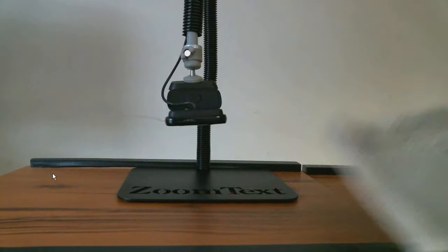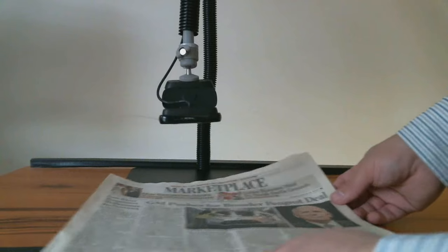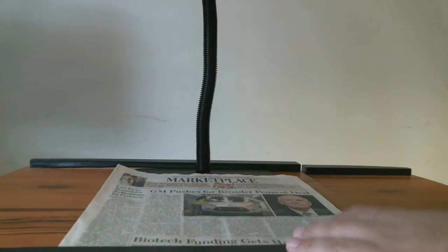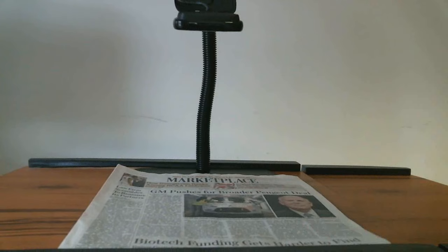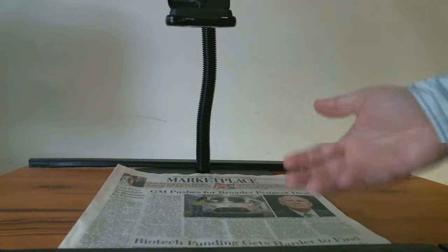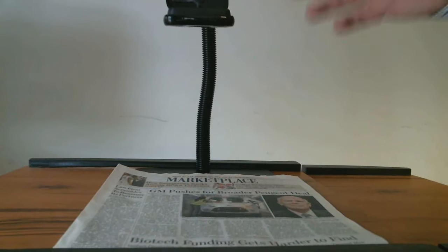So let's say I had something like a newspaper that I wanted to read. Okay, you're obviously going to put that underneath the camera so that you could move the printed material underneath the eye of the camera. Now, one thing you want to keep in mind, you don't want to have the camera way, way, way high up. It's out of frame here now, but if I had it way up here, the text isn't going to appear very large on screen. Yes, you can magnify with the ZoomText Camera feature in ZoomText, but the amount of magnification to see this text large is going to be very high, which means that the text quality is going to appear very jagged on screen since we're just magnifying digitally with the camera.